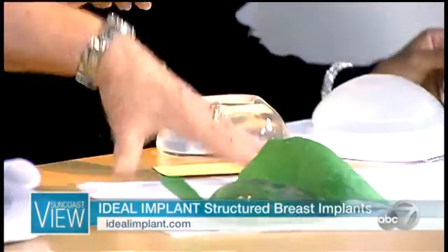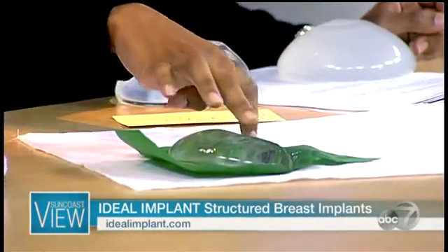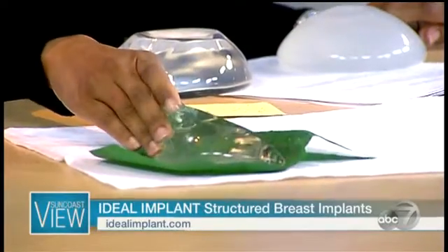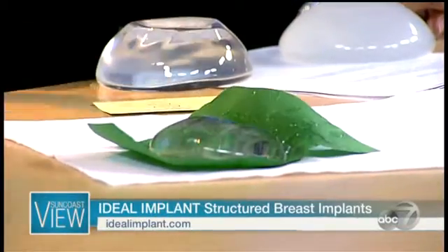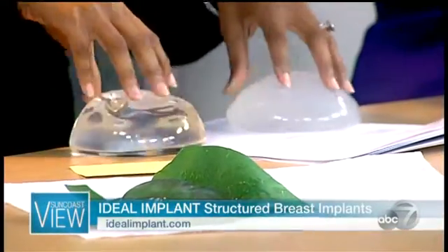But at the end of the day, they're not saying they're not safe. But this was really what women gravitated towards because they wanted a more natural feel. With saline, they felt like it was that watery feel. But since they have these little chambers in there breaking it up, you have the same feel. You actually have a more natural feel, and you have it with a saline implant. So natural feel with less concern of rupture, and then no need for MRIs every 2 years.